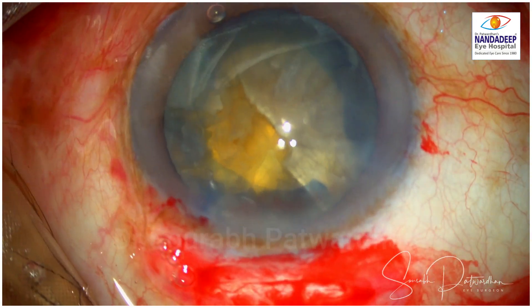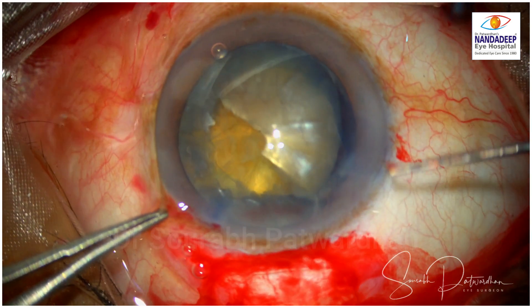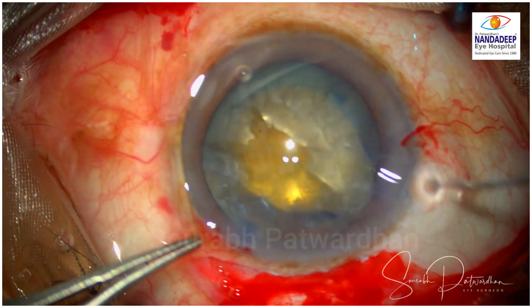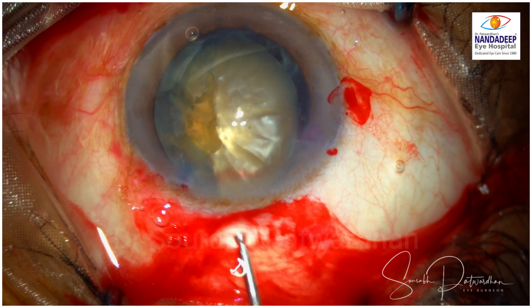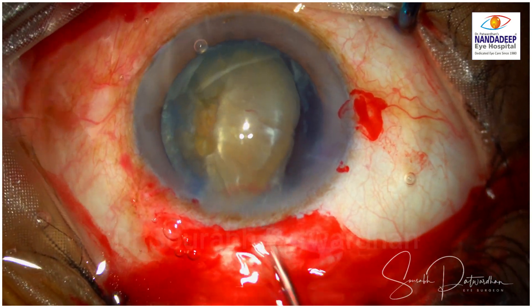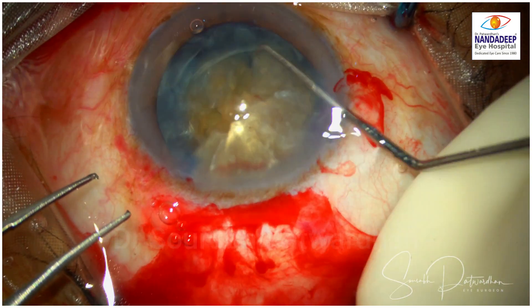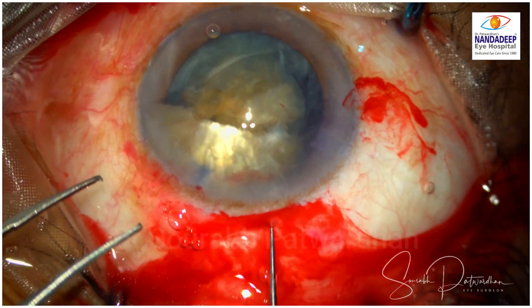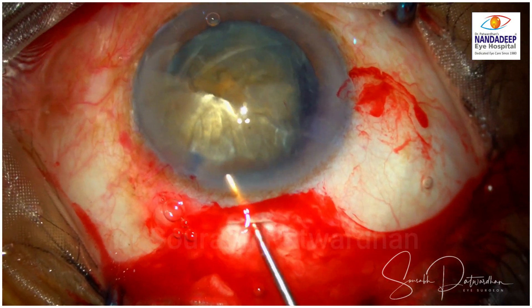I am going to use the visco expression technique. The skill here is to take this nucleus out from the bag. The CCC is small but there is already a radial tear, so I am going to rotate this piece. You can see it is partially chopped, so the two pieces are still joined to each other — which is good — because I can rotate one piece slowly and then bring the other piece also out of the bag. It is important that the entire nucleus is in the anterior chamber before I start removing it through the scleral tunnel.